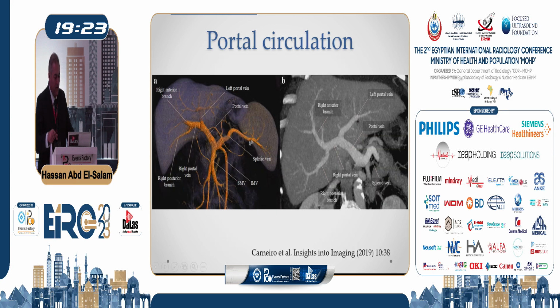CT reconstructed images of the portal circulation, as you all can see. Right branch, left branch portal vein.